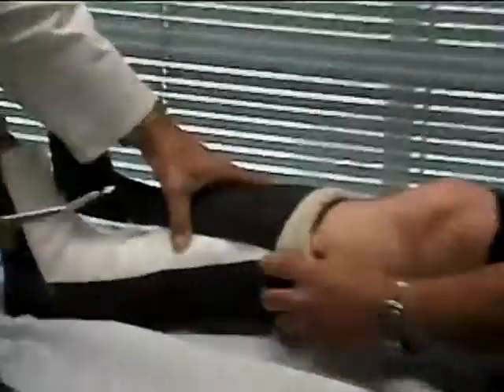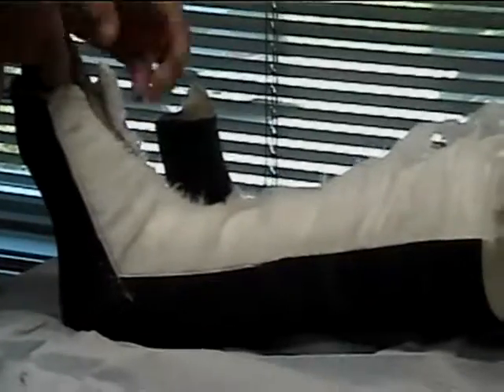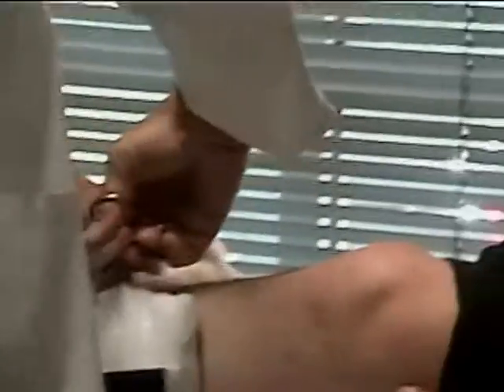When we started, it was put on, and every Friday we would take it off, stretch the foot more, and put another one on every week for five weeks. The last week it was kept on for two weeks, and now it's coming off for good. Thank God.